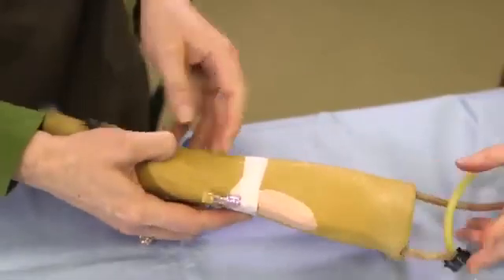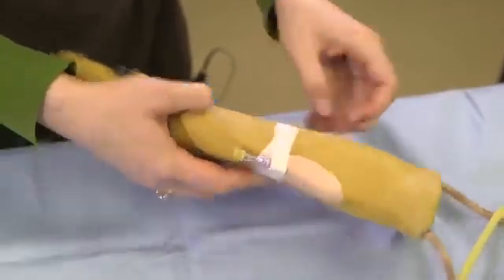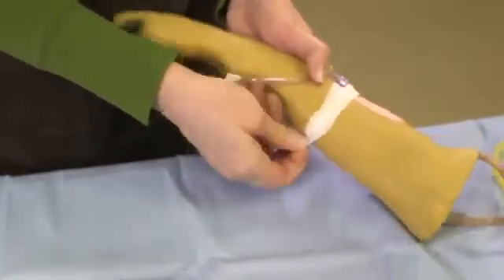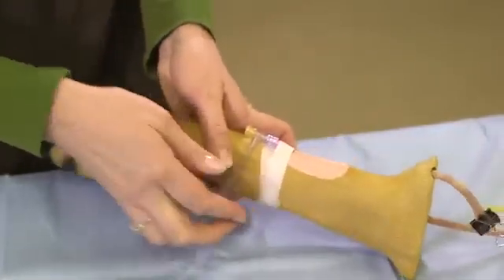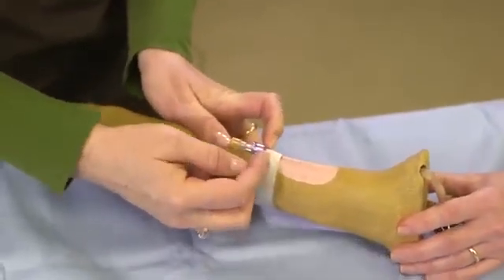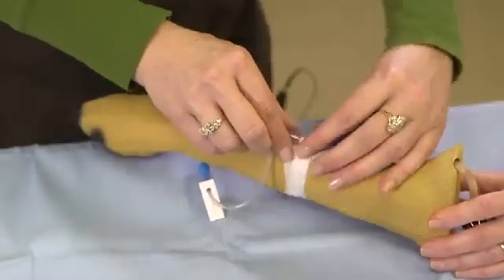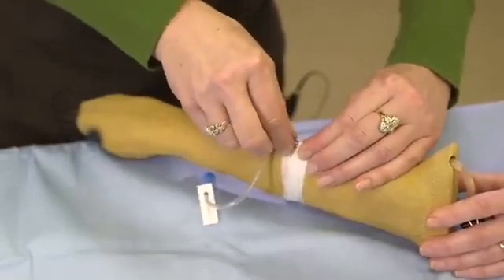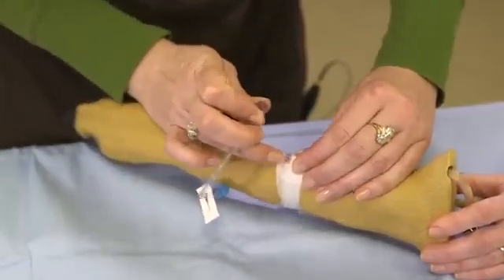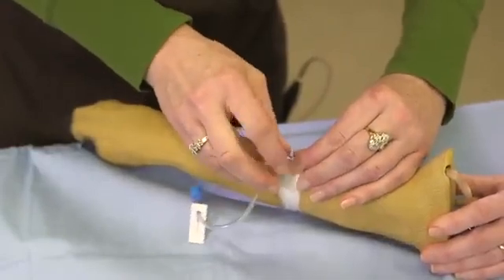Now, one thing to keep in mind is what's going to happen when it comes time to take all of this off. It's a good idea to take these pieces of tape and make little tabs. That way it's easier to grab. The other thing you want to always be mindful of is you want access to the end of your catheter. If this were to fall off, you would then have a mess. You want easy access. I'm going to pretend this falls off. You want easy access to this. You don't want tape covering all this, so make sure that is exposed all the time.